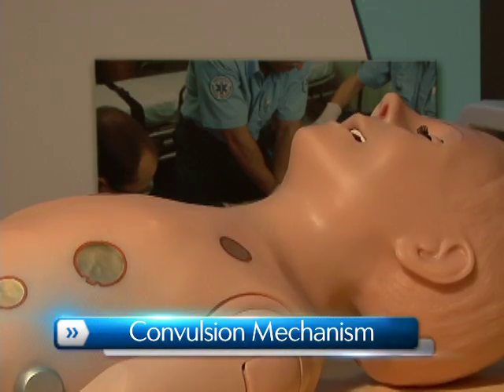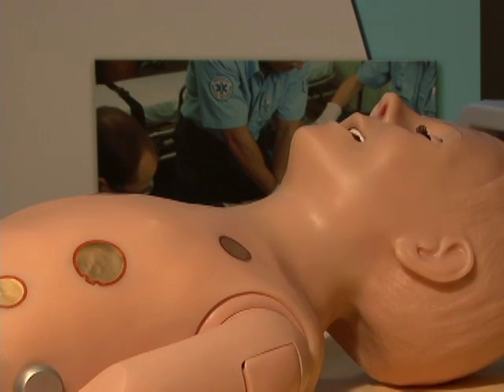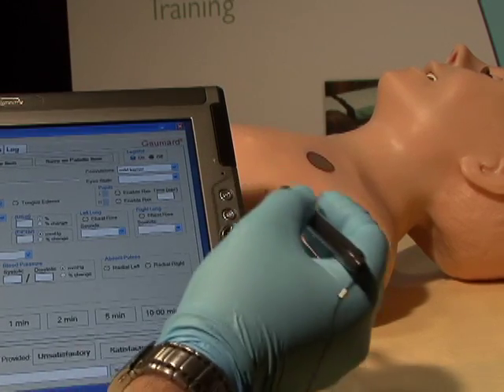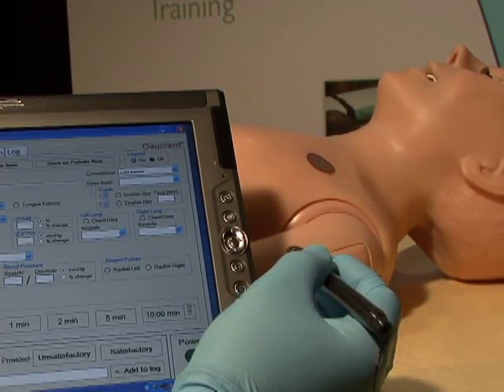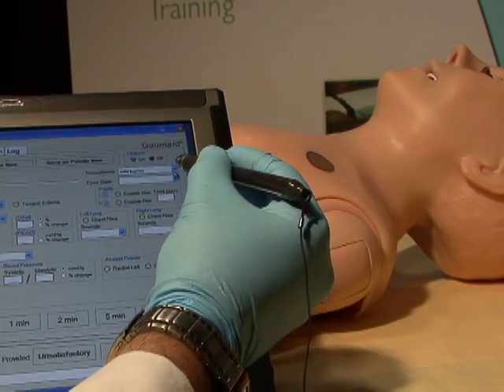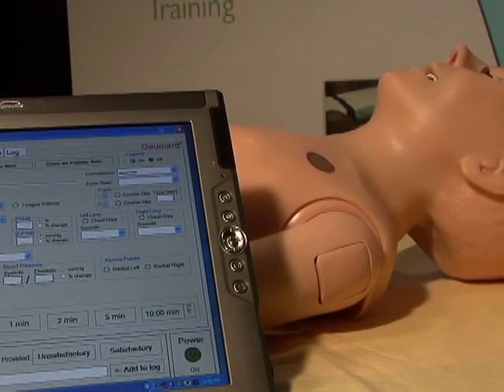Pediatric HAL is outfitted with a convulsion mechanism that can be used in conjunction with scenarios. The severity of the convulsions can be programmed with a touch of the stylus. There are two intensities to choose from.